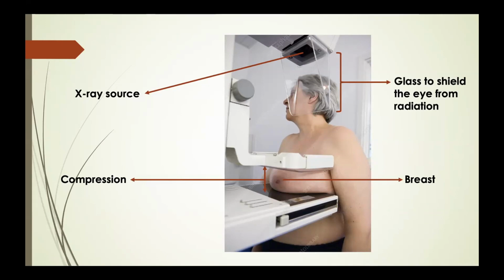Just like the last speaker said, or was it a question somebody asked, we are talking about using radiation to treat cancer, but radiation is like a two-edged sword. It can treat cancer and it can also cause cancer. So in using radiation from a mammography machine to diagnose a patient, we don't want to induce cancer in that patient, nor do we want to expose the operator to the extent that he or she is at risk of developing cancer at a later stage. So this is shielding from the radiation.